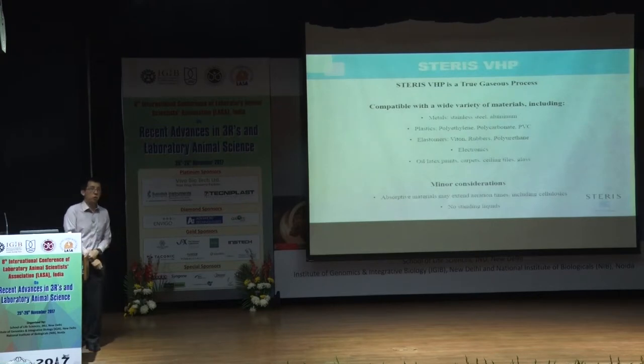So just to clarify on the service, VHP is actually a true gaseous process. It's compatible with a wide range of materials. We have articles to back us up on that. And of course, every technology has limits. We talk about the aeration part: as a gas, it may take a longer time to dissipate from all surfaces and areas. And of course, no liquids, because as a gas, it can't penetrate the liquid.